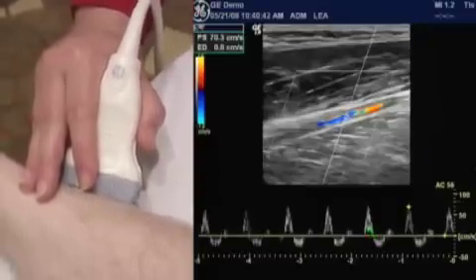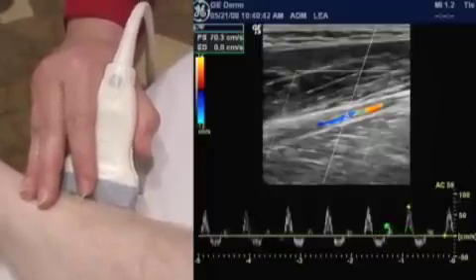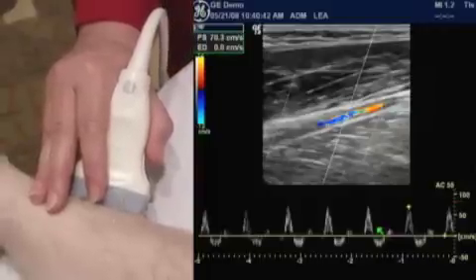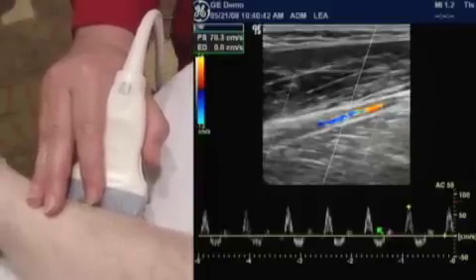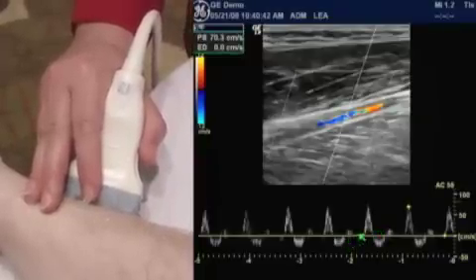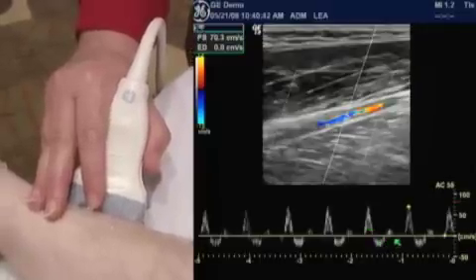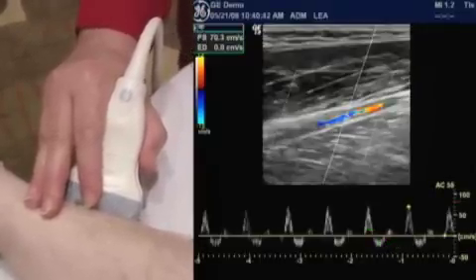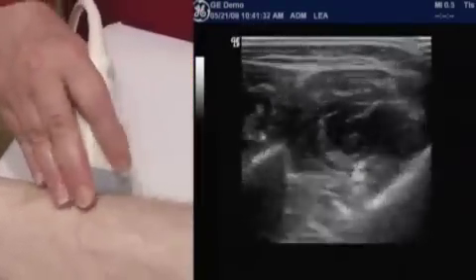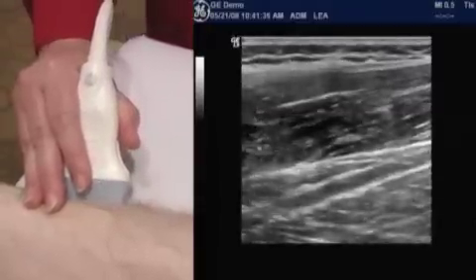If we see this, but then we see a lot of diastolic flow, then now we know we're in a low resistance bed, and that could be the result of disease, or it could be a hyperemic state. But this is what we want to see pretty much in any artery outside arms, legs, so forth in a normal individual. So from here, we would follow and continue to follow on up, whatever mechanism is easiest for you.